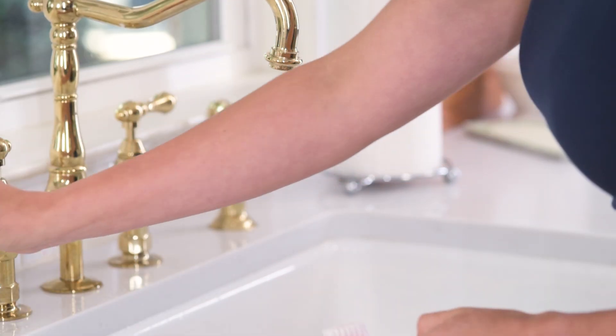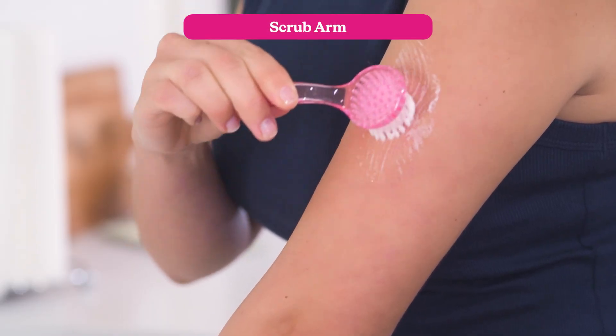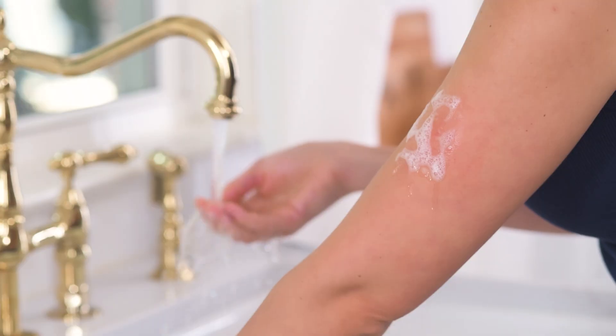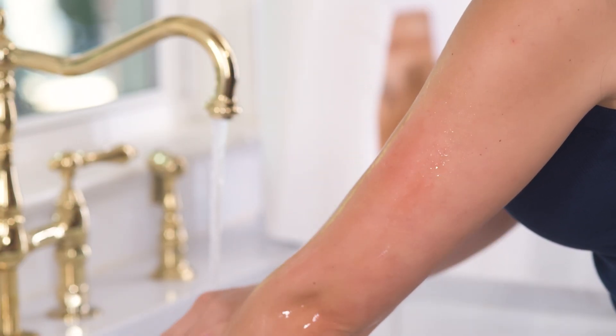Add soap to the exfoliating brush, wet it, and use it to scrub your arm in a circular motion for 30 seconds. Then rinse with warm water and let both your hands and arm air dry completely.